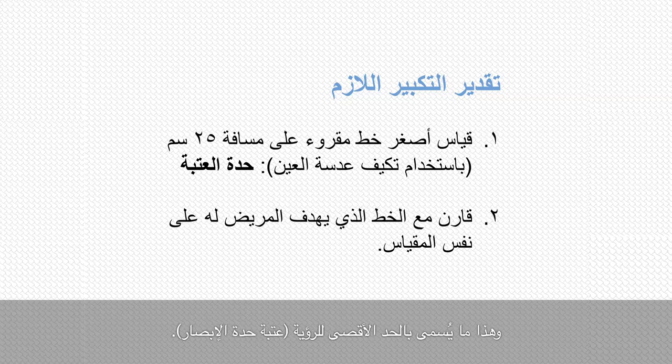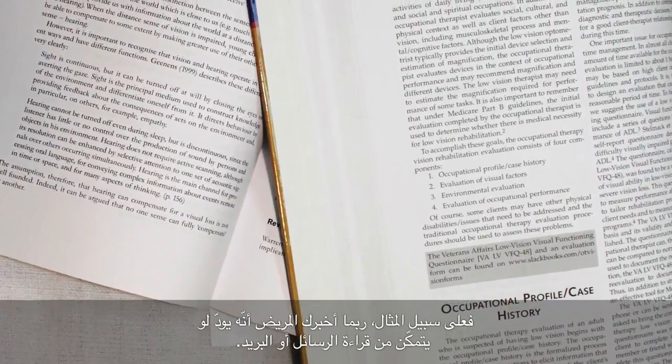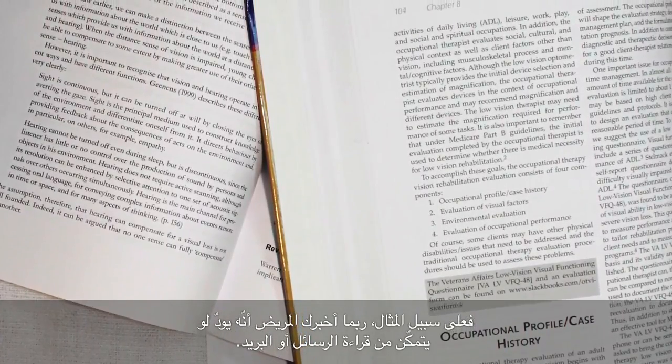This we call threshold acuity. Threshold acuity tells us what we can read when we're pushed. It's not what the patient can sustain. But using the goals that we set in our assessment of need, choose one of the problems we're going to try and solve. For example, the patient may have said that they want to be able to read the letters or post that comes through the door.